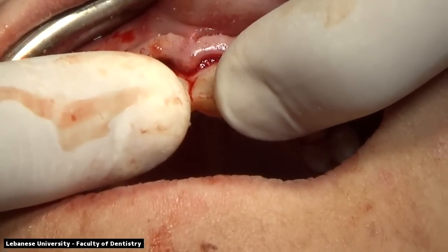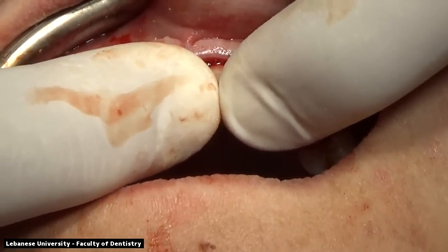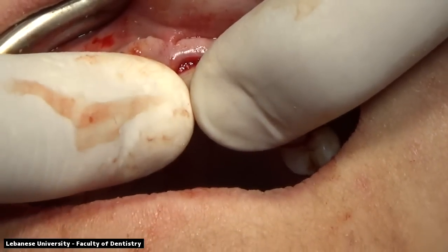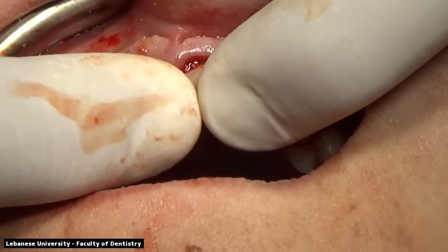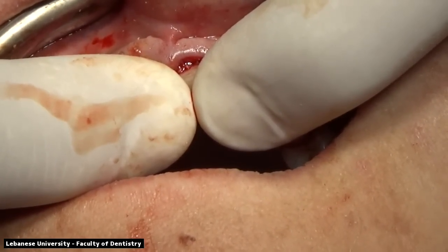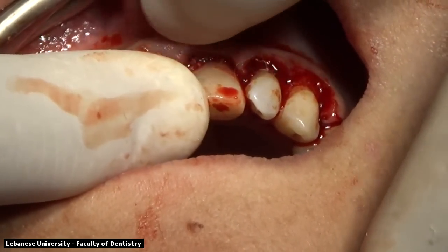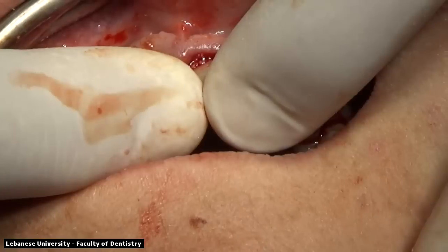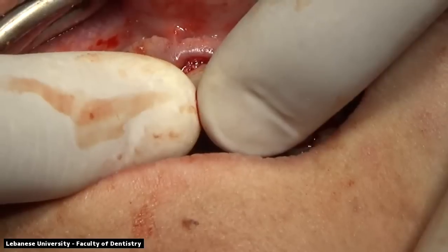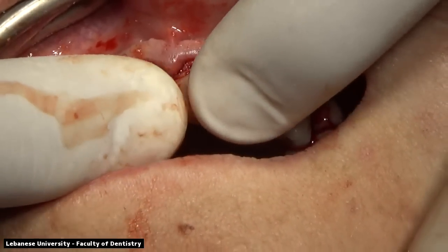This will need some time for it to set, so we're making sure that we're pressing so that we are exactly where we want it to be. We don't want any movement. This movement will create some gaps because when the temporary restoration is drying up, it might create some viscoelasticity, and this will change the shape of the provisional restoration. There will be some gaps between the margins, so we make sure that we are pressing really hard and we're all the way to the margin of the abutments on both sides without removing our fingers until the setting of the material.